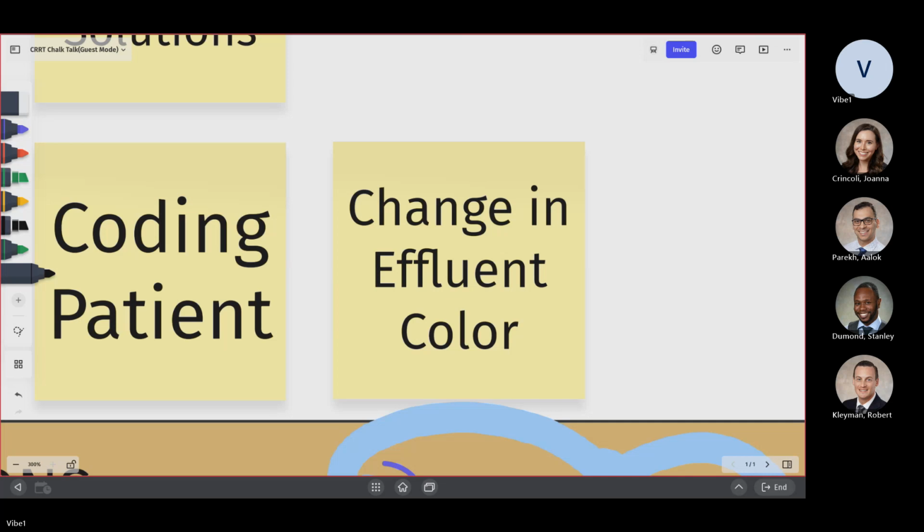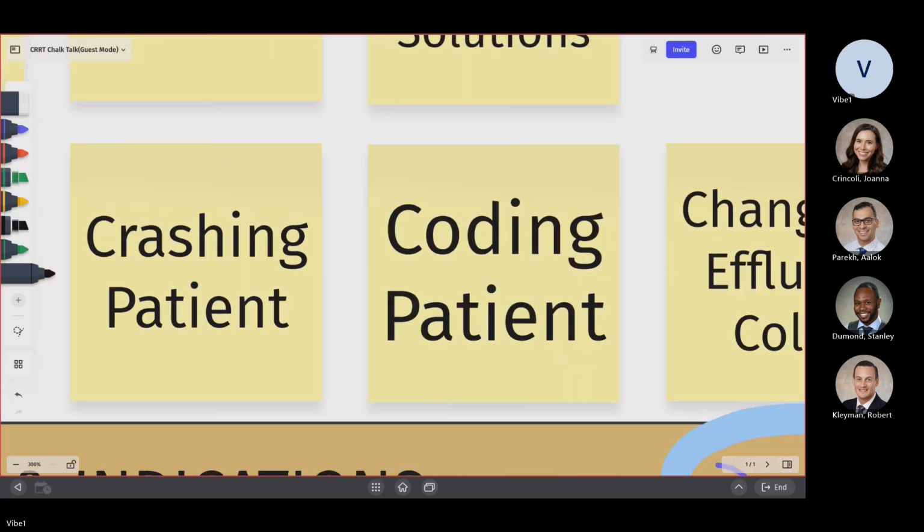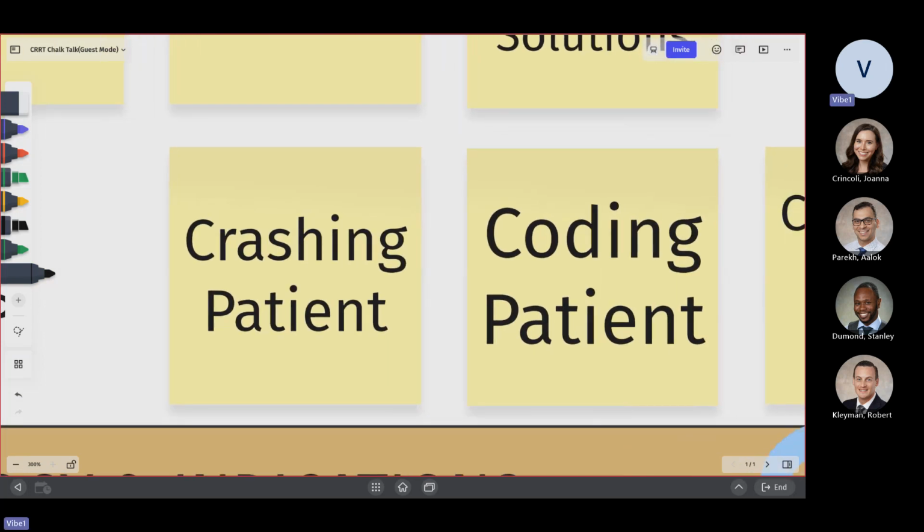About the cartridge life, the maximum I think is around 3 or 4 days. They usually have the time on the machine. It all depends on how sick the patient is. We have had patients where they have lasted long, and we have had patients where it didn't last long.